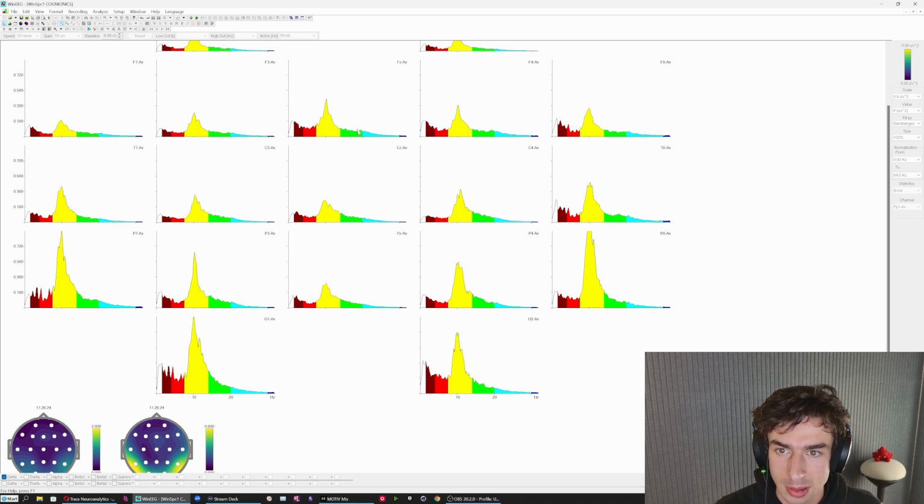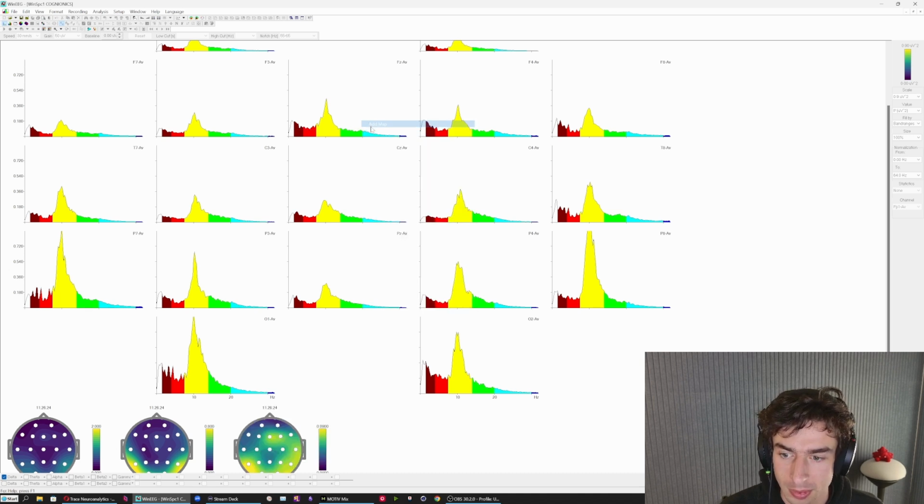And if I scale this up so that we can pick out a beta peak, again, the beta by its nature tends to be more diffuse in the frequency spectrum, but we'll pick something out anyways. So why don't we pick this out right here at 19.5 hertz.